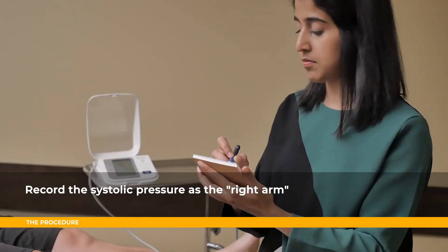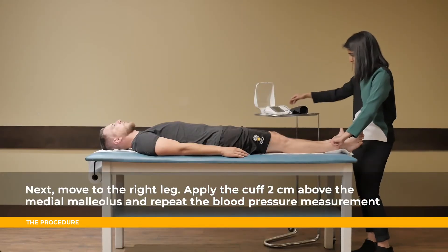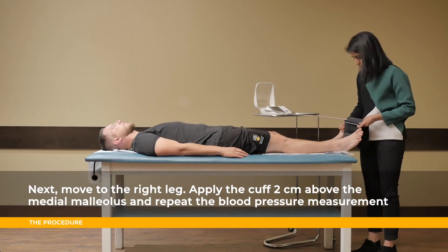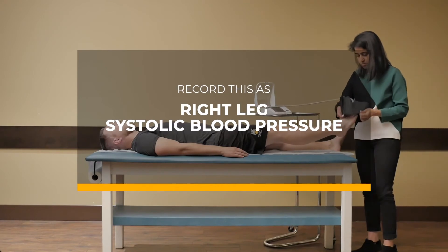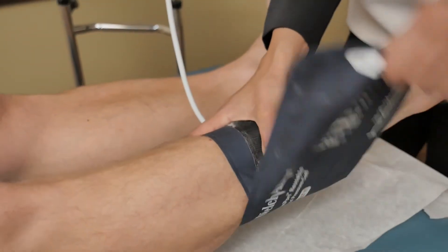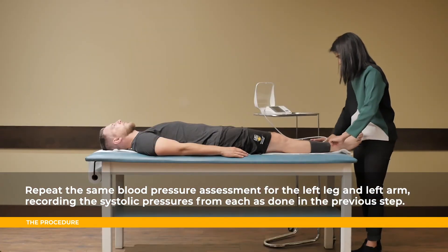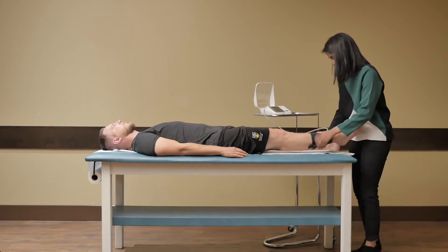Record the systolic pressure as the right arm. Next, move to the right leg, apply the cuff two centimeters above the medial malleolus, and repeat the blood pressure measurement, recording this pressure as the right leg. Then repeat the same blood pressure assessment for the left leg and left arm, recording the systolic pressures from each as you've done in the previous two steps.